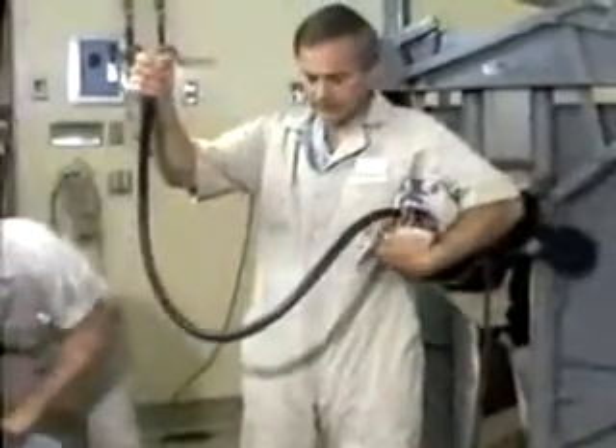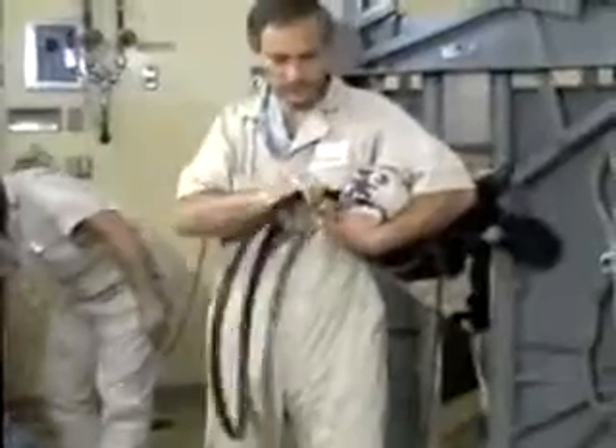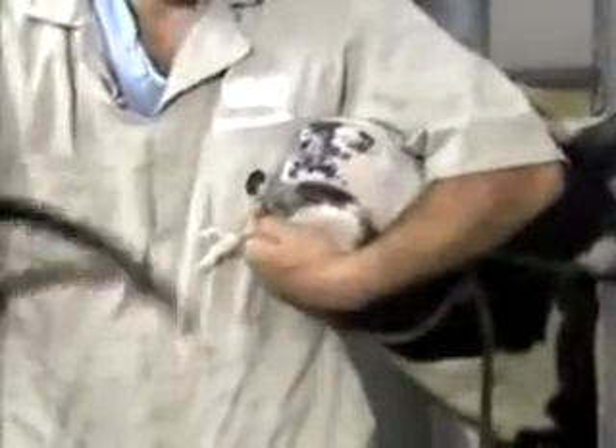Once the medication is administered, you pull out the stomach tube. Before the Frick tube comes out, remember that the purpose of the Frick tube is to keep the cow from chewing on the stomach tube. At this point, the Frick tube can be pulled out and the operation is complete.